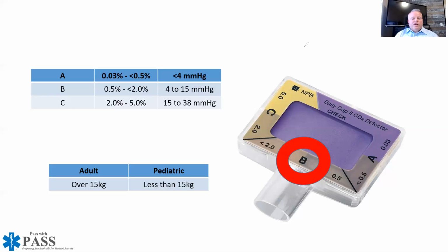So here's where I'm going to challenge you guys a little bit. Everybody yesterday, me included, and I think you guys would agree, would say that if I put this on and I get a color change, then I know I'm good. Well, that might be true. If it's purple and it goes to yellow, and you have that yellow color change, we're in that range, and let's just call it a 3.5 or a 4 up to a 5. Look at what your end-tidal CO2 reading is though.